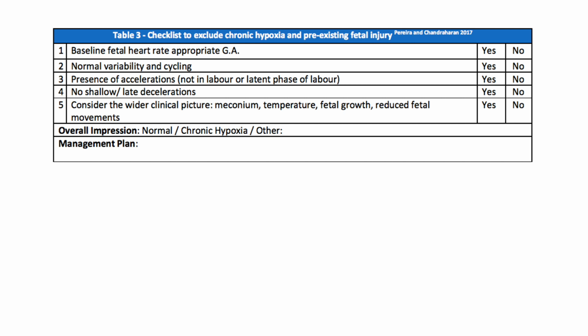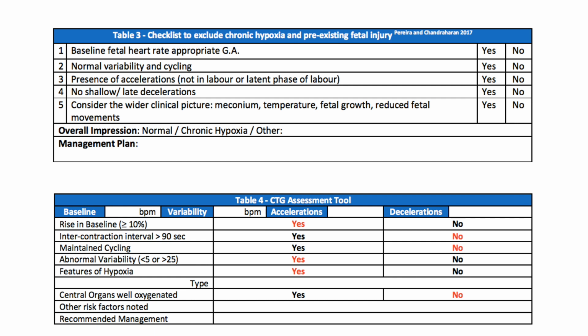The physiological guidelines have two checklists or stickers. First checklist is to find out, how is this fetus? Is this fetus fit to undertake the journey of labor? The second checklist is to be used every time a CTG trace is analyzed during labor.